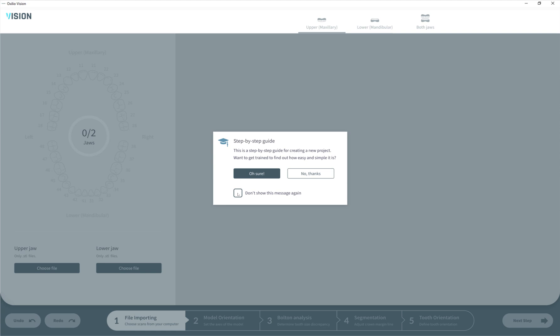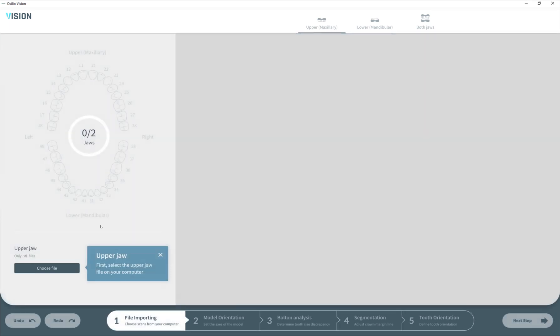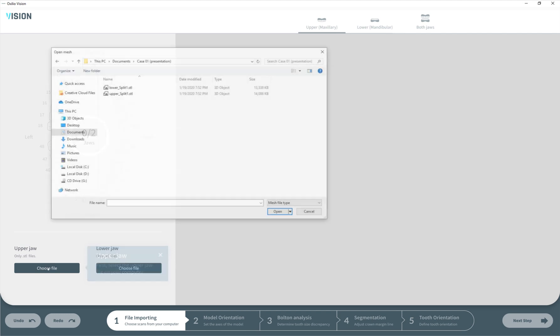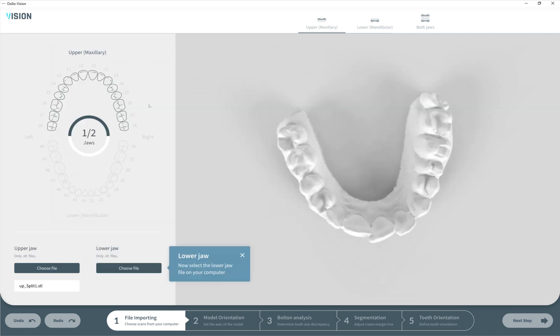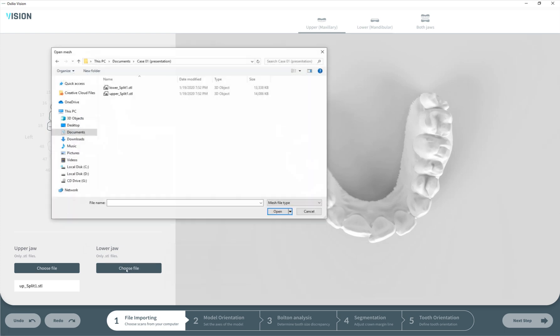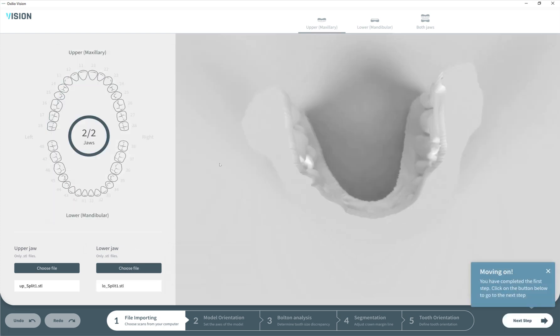Here we can disable the guide when we finish the study process and don't need it anymore. Let's keep it for now. First, we need to upload the upper jaw file, then do the same for the lower jaw. The first step with file importing is complete.